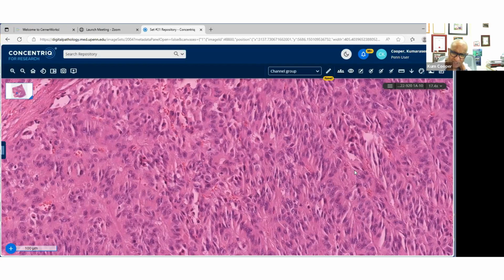that's again desmin and actin. I do the sex cord stromal markers, inhibin and steroidogenic factor 1, SF1, and then epithelial markers. So those really are positive for those three. You could resort to genetic testing for those as well. It's ESR1, I think, and GREB1 is the other gene that's involved in that. I've not used any of those molecular tools. I typically look at morphology and my immunohistochemistry to make a diagnosis of UTROSCT. We've seen a handful here over the last few years.